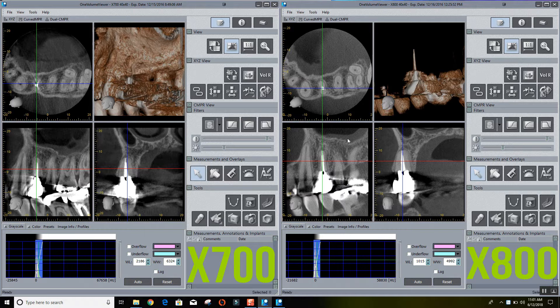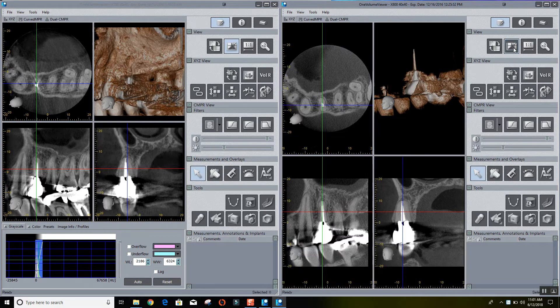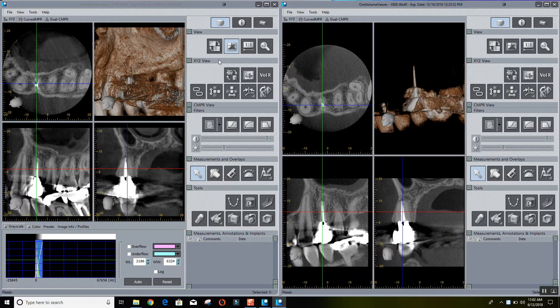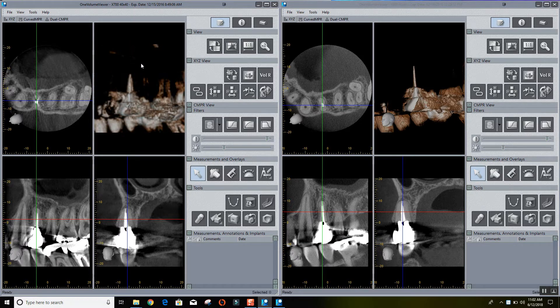We're starting by manipulating the histogram to adjust contrast and brightness. Now in our volume render view, we're filtering out softer tissue just to get down to the gutta percha and the actual restoration, so that we can examine those between the two machines.